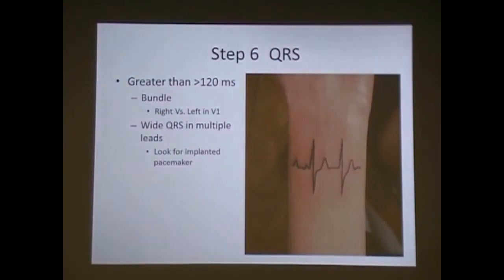The reason that we would put a pacemaker on the right is because of some kind of venous irregularity. So when we're putting in pacemakers, we'll shoot contrast up and see the kind of venous flow that we can get the wires down. So once in a while we go right, but I'd say 85–90% of the time we're going left. So if you throw your hand on the left side of the chest wall, you're generally going to feel the pacemaker, and they're getting smaller and smaller.